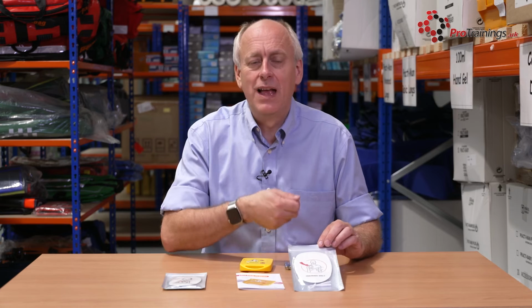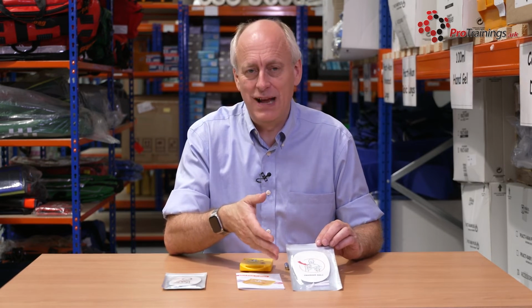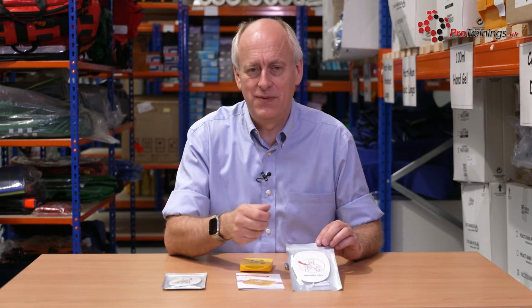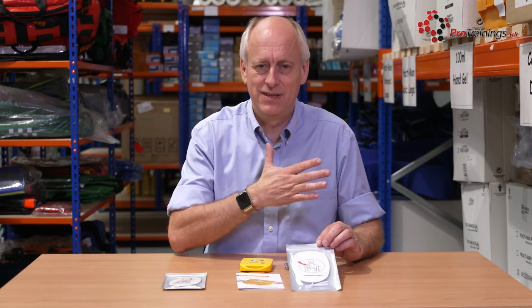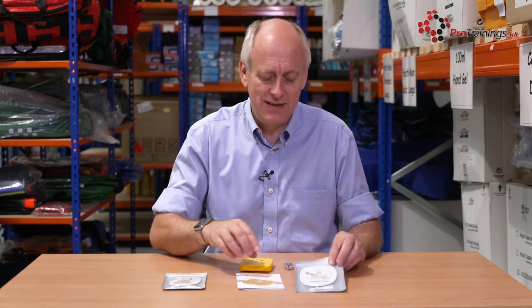Pads are reusable. They will last quite many times to use, but eventually they are going to wear out. But you can usually clean them with a damp cloth just over the surface. They're designed to be stuck on and cleaned off because it will get a bit dirty, but ultimately you just need to buy those later on.